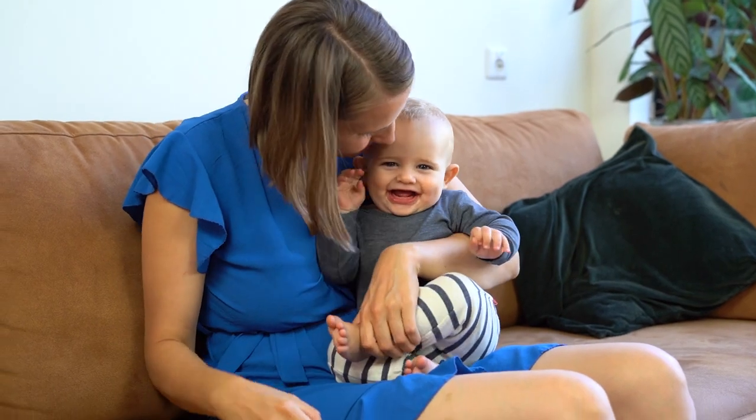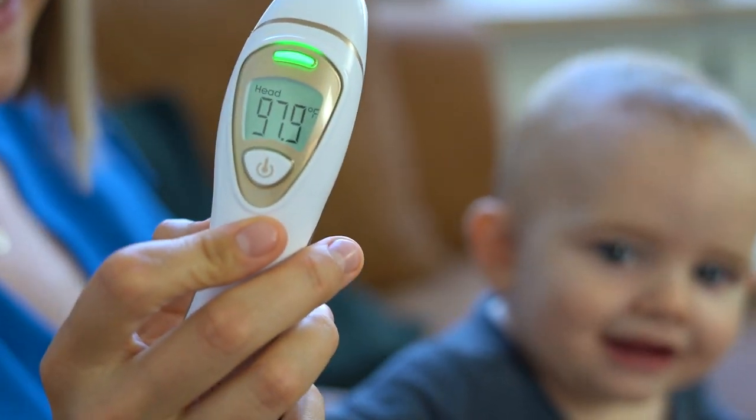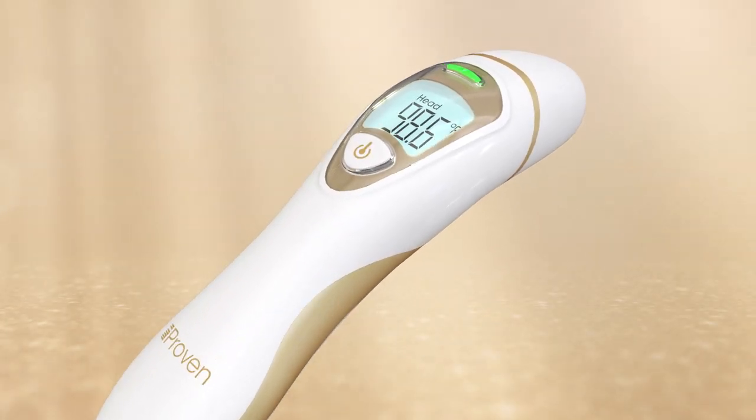It is easy to use and provides quick and precise results just with the press of one button. The touchless forehead measurement mode is a quick, convenient, and hygienic way to measure your temperature. Point the thermometer towards the middle of your forehead at a one-inch distance.